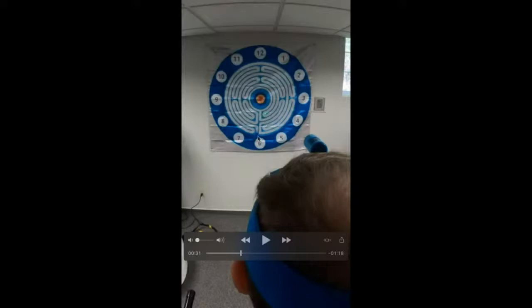But with the orthostatic tremor that I'm seeing, my patient that has just a basal ganglia issue, but it's much less common than Parkinsonianism, but it's not Parkinson's disease, is moving through the maze. She will still freeze a little bit, and she'll start to shake with her tremor. The more that she notices that she freezes, the more tremor she gets. So she's been working on this and working through the maze, reducing that freezing and bradykinetic response, and she's improving her time through the maze.